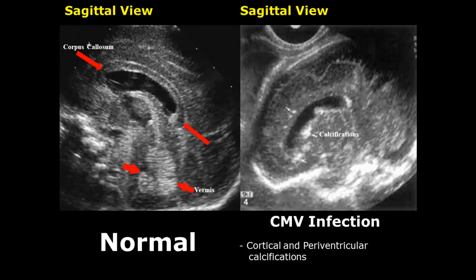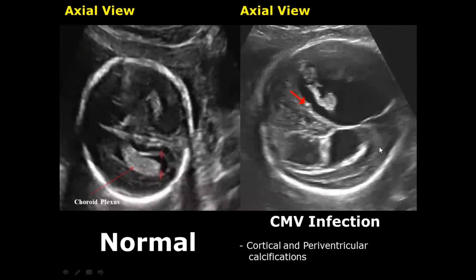CMV infections — from cytomegalovirus — can occur in the fetal brain and present as calcifications in the brain tissue. Here you can see small calcifications; when such calcifications are noticed, it can indicate a CMV infection. Here is another axial view showing small calcifications in a CMV infection.